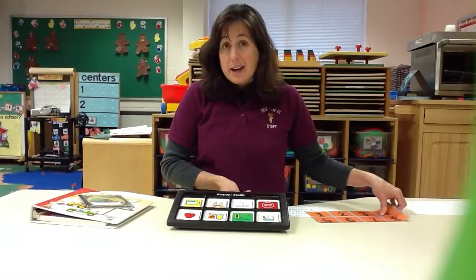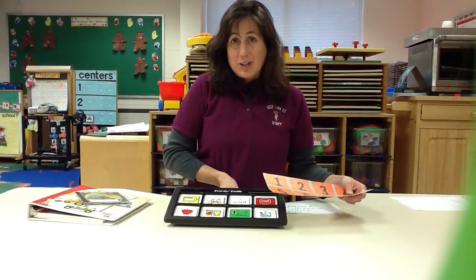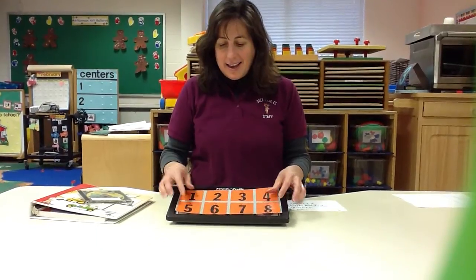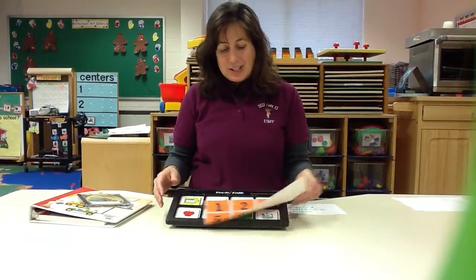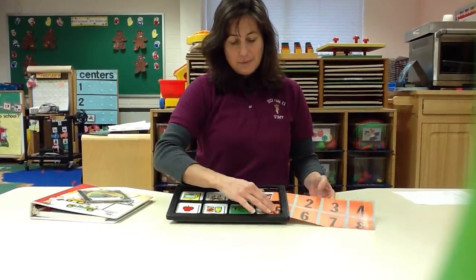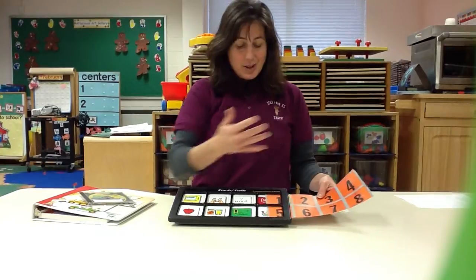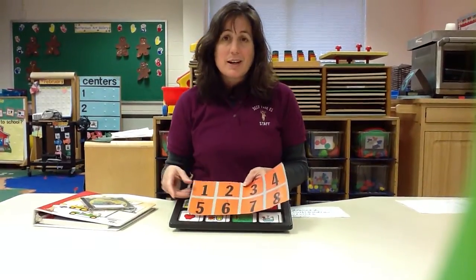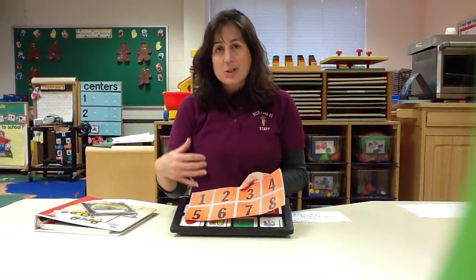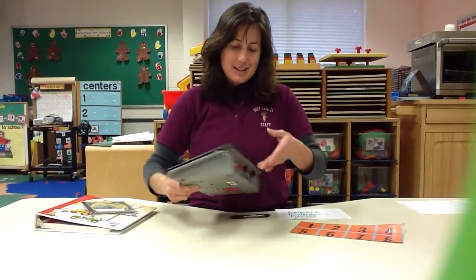So this board can be switched out also. And you can use the tool for instructional methods. And this has numbers, so I just put this board in and replace it. And I can do the numbers 1, 2, 3, so forth. I could also use story pictures, and a child could retell me a story or answer a question I had about a story.